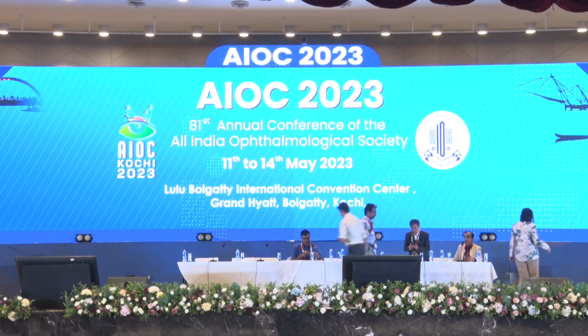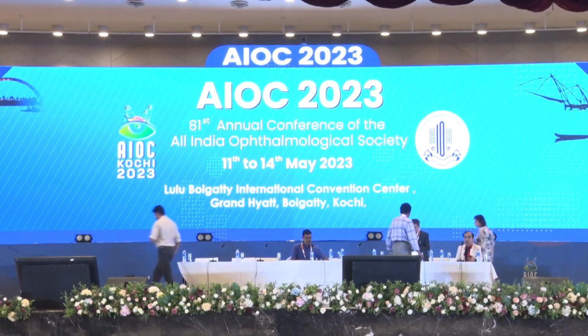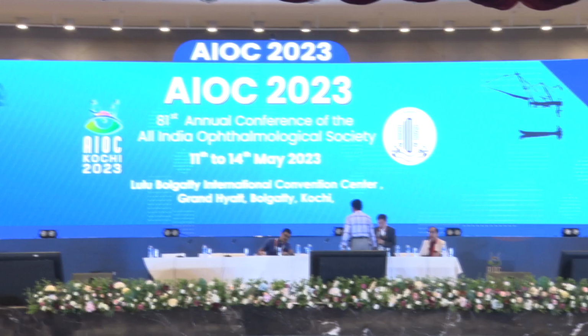We are going to discuss the nucleus removal. As we know, the nucleus is the only part which needs the phacoemulsification machine, and all other parts can be removed manually without any problem. So in a different scenario, how we are going to handle the nucleus, that is what we will be talking about. I will be covering the basics of nucleotomy.